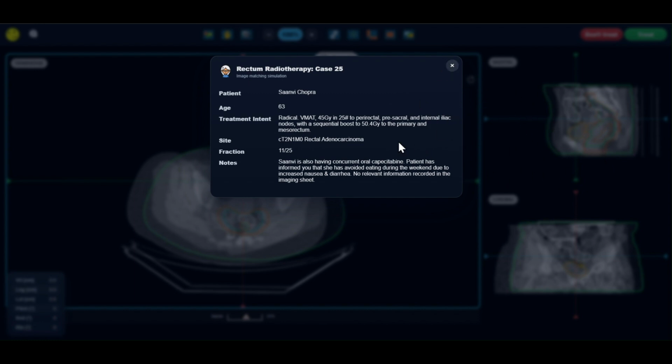So let's look at Gy. Gy stands for gray. As some of you may already know, this is the unit of absorbed radiation dose. That's a universal unit which indicates how much dose a patient is taking in.